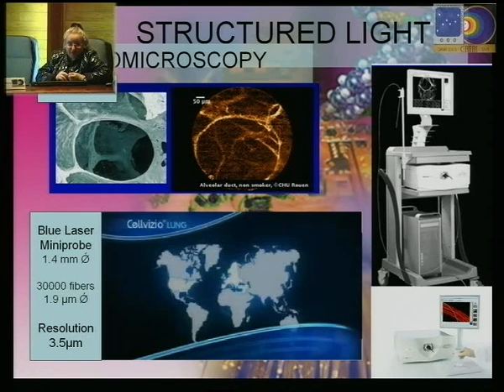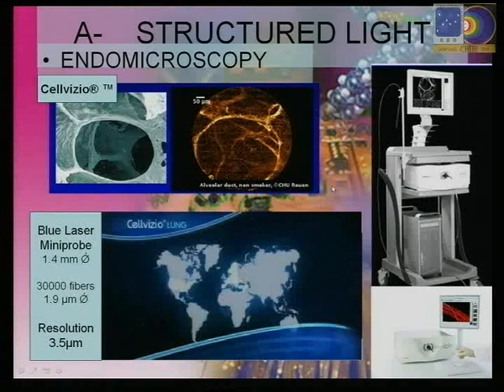Obviously, now there are confocal probes in which there is only a single fiber. This single fiber has to have very high quality material in order not to spread and lose the light.